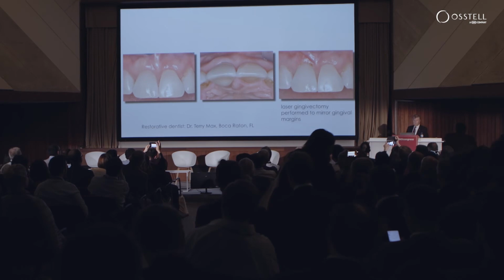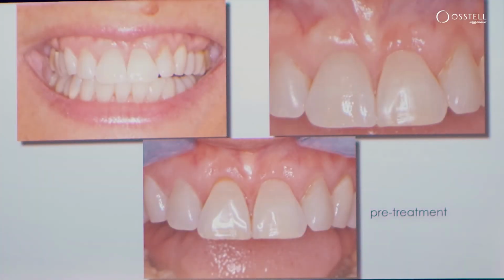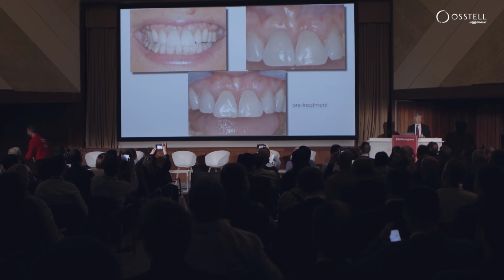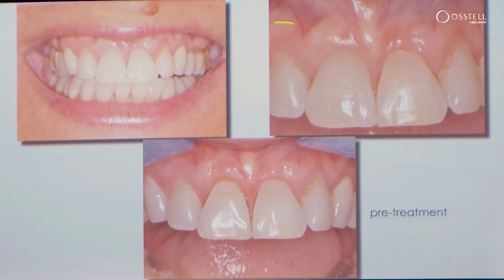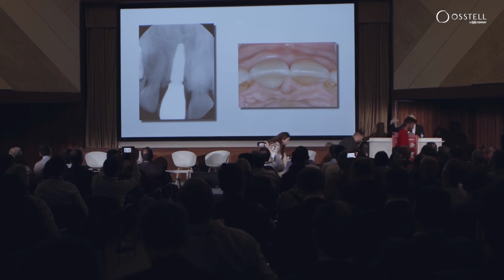She complained a little bit because she thought there was too much gingiva on the facial of the final restoration, so we went back and did a little laser gingivoplasty. And if you look, you can see now how high she smiles, where she shows the gingival margins of everything. And again, if you compare the pre-treatment, where we have some pre-existing recession, to the post-treatment, we have a near perfect replacement and restoration. So I think this sort of illustrates what's possible if we follow these 10 keys, one of them being obviously maintaining that primary stability and knowing it in the first place.